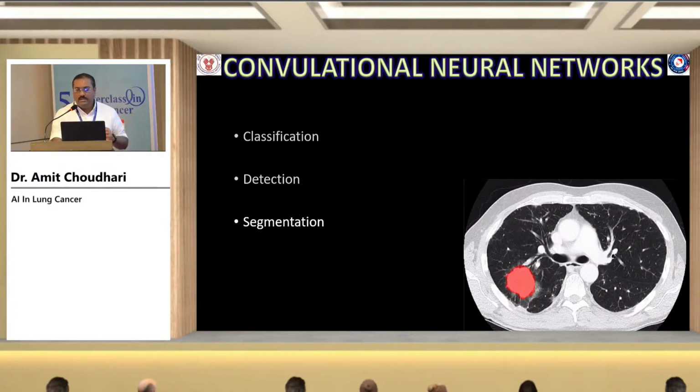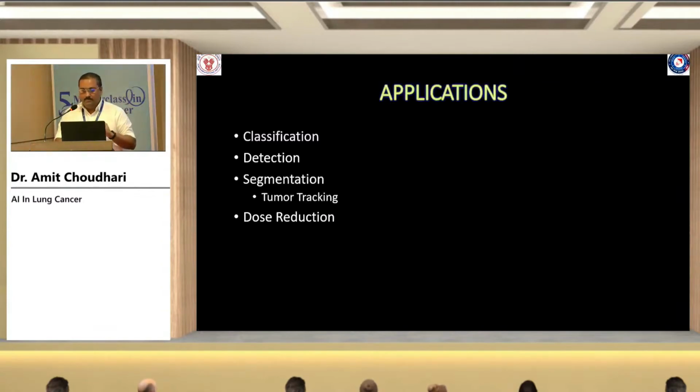And then eventually segmentation. So segmentation is nothing but mapping or assignment of pixels to a particular abnormality or area of interest. So as a human, it is really easy for us to draw an outline along this mass in the right lung, as seen over here. But using CNN-based techniques, it involves very research-intensive processes for actually coming out with accurate segmentation, or deciphering this lesion as being separate from the normal parenchyma.